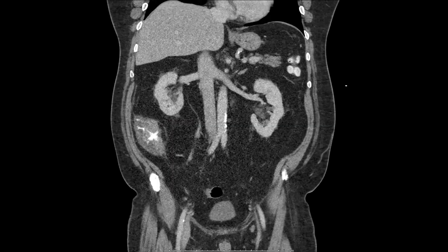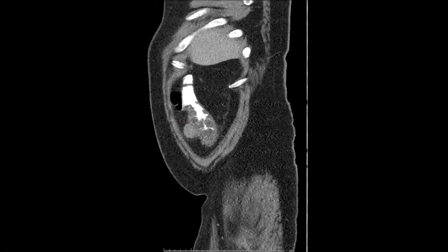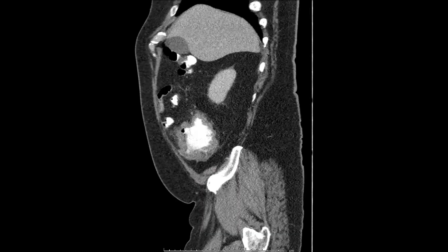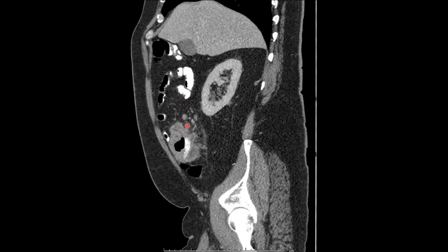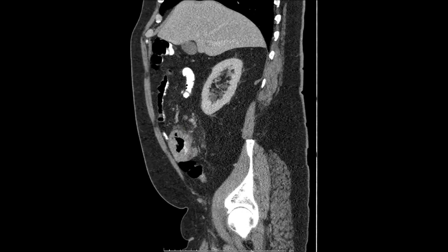Scrolling along, we now reach the sagittal reformatted images. Check out that polypoid wall thickening and notice how it's also isodense to the adjacent skeletal muscle — that's a key feature for lymphoma. Here we see another feature sometimes seen with lymphoma: the bowel is aneurysmally dilated, and contrast passes through this region without obstruction. We see again that mesenteric lymphadenopathy there.